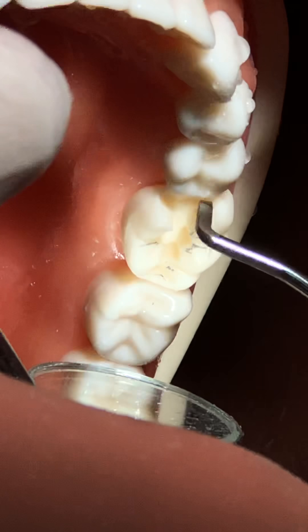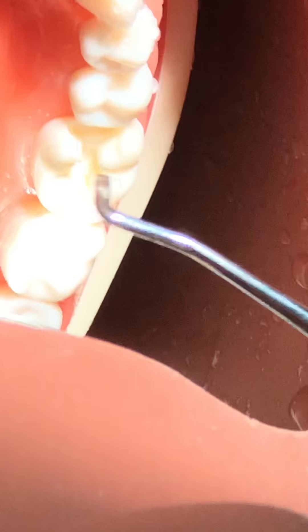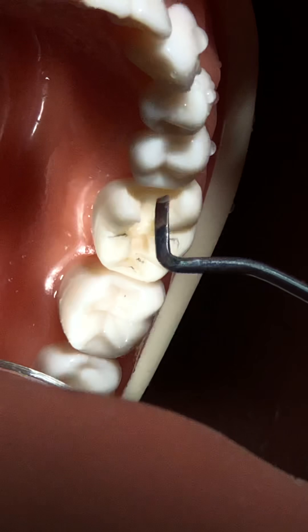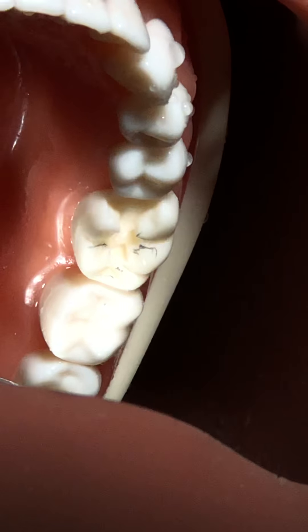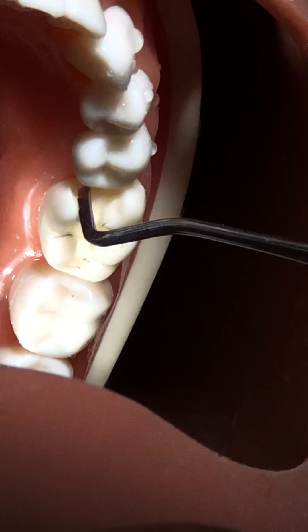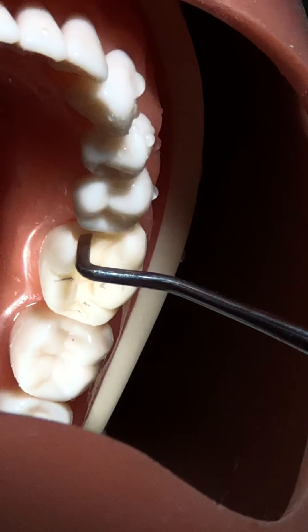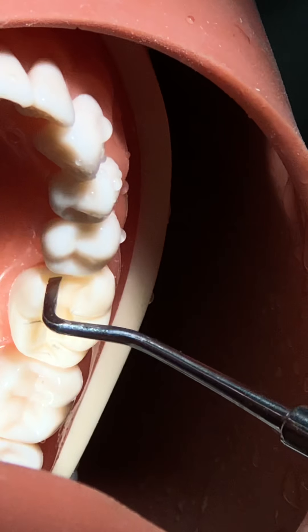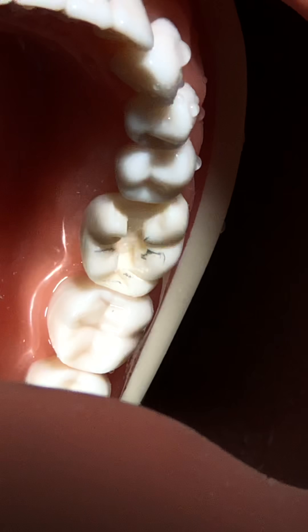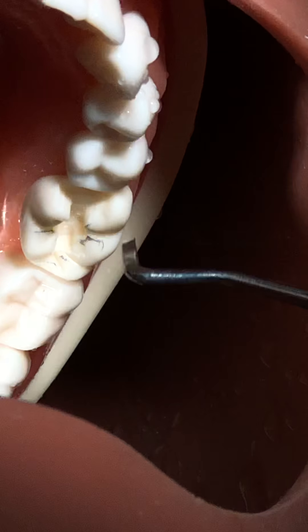There must be a step between the occlusal and the proximal part. In the proximal part, the rule is you must cross the contact point and go deeper, so there will naturally be a step. If you don't want a step and cut all the way making a straight pulpal floor, the problem is that there is a pulp beneath on the occlusal side but not on the gingival side - so you'd expose the pulp. A step preparation is therefore a more conservative preparation.